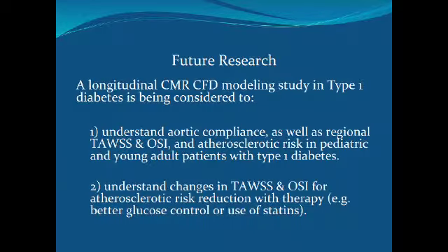I would say that we would probably consider a longitudinal MRI and computational study of diabetic patients to understand aortic compliance as well as these regional changes in atherosclerotic risk. How does it change as the patients age? The patients that we scanned 5 years ago are now, some of them, in their 20s.